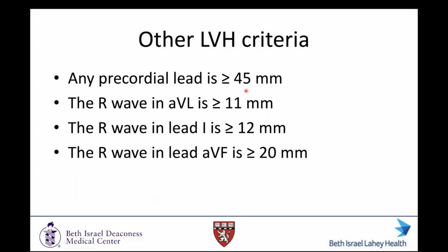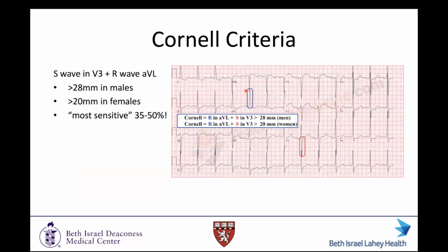Yeah, that's a good question. None of them are perfect if you actually go back to the one more previous slide, the Cornell criteria. The sensitivity of these are poor.